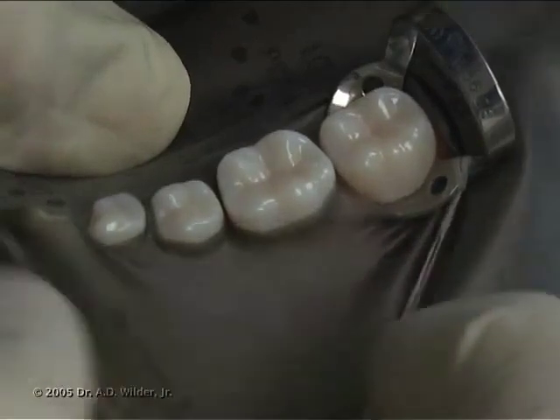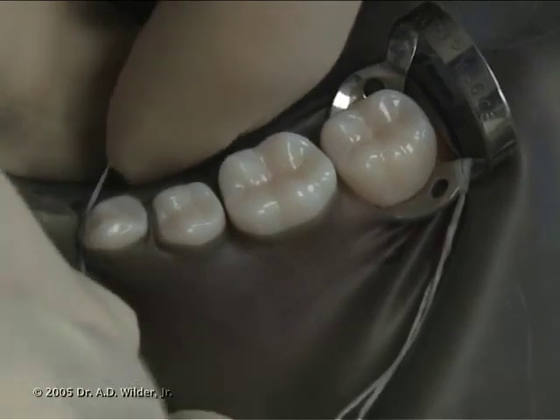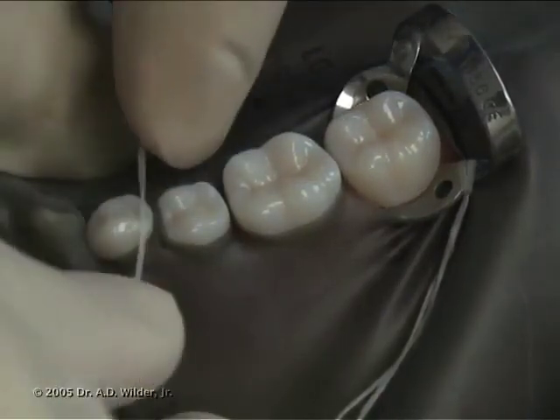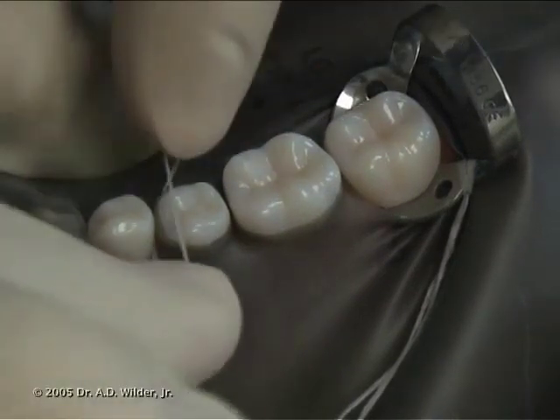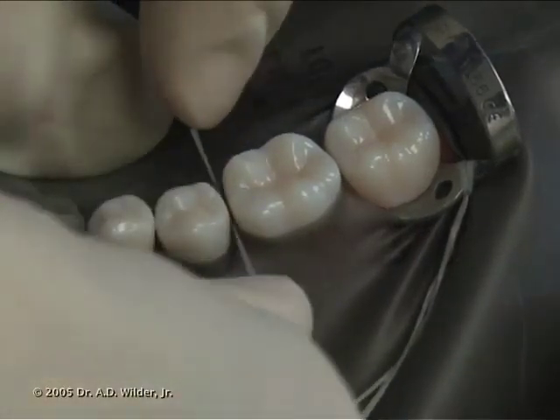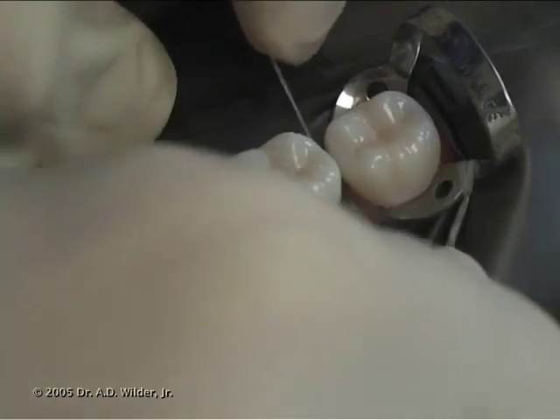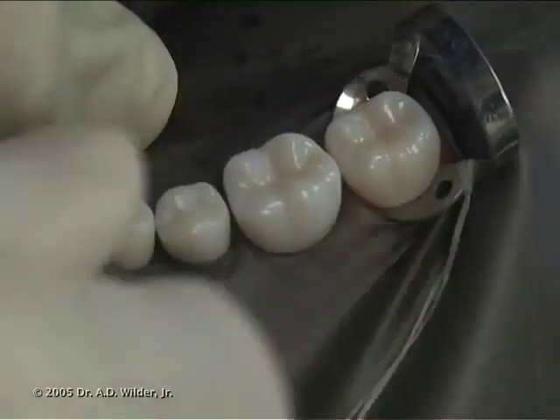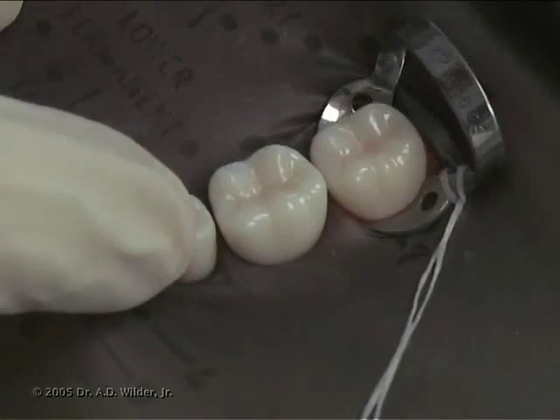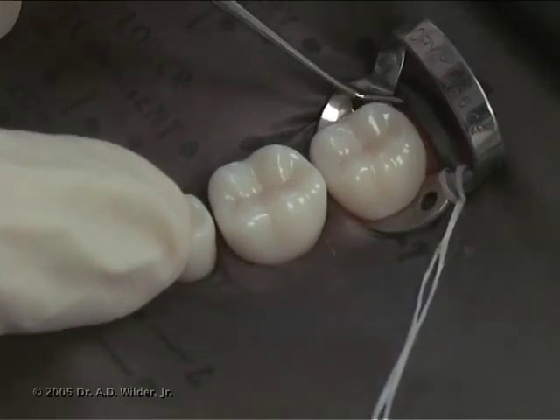You can use floss to allow the rubber dam to adapt around each tooth more cervically. You can use a blunt hand instrument to help pull the rubber dam close around the anchor tooth underneath the clamp.